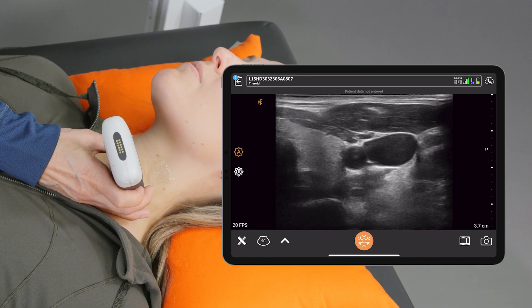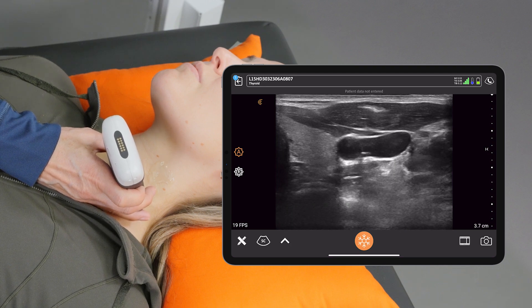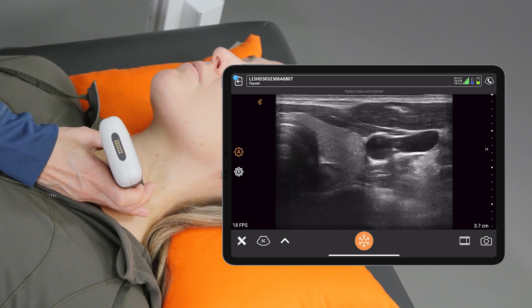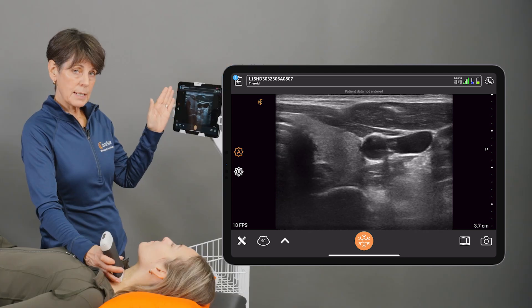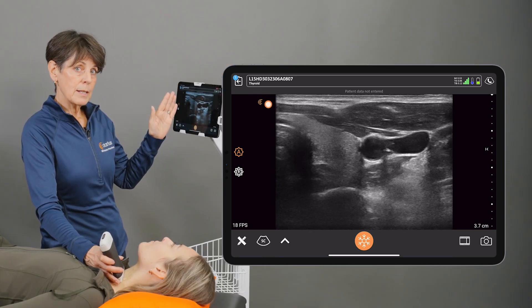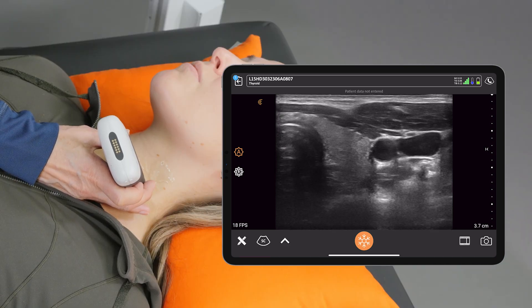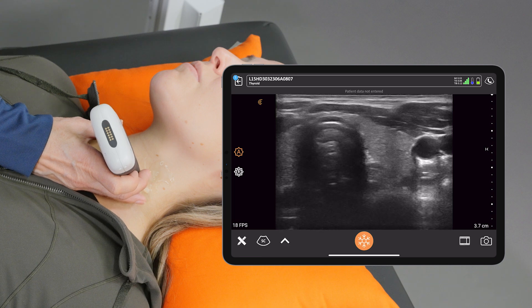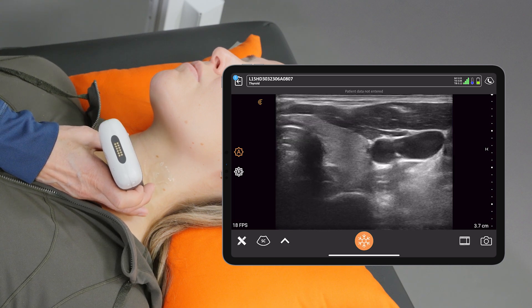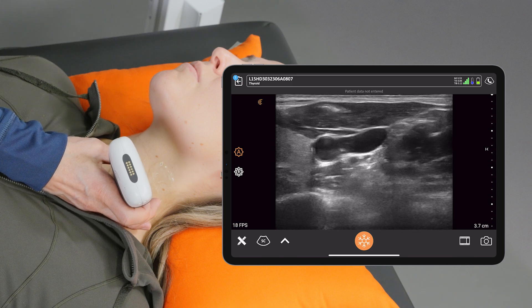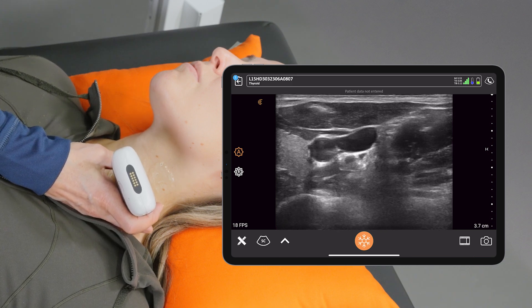When you're imaging in the transverse plane and I have that indicator to the right of the patient, everything on the ultrasound image that is on the indicator side of the image is to the patient's right. So if I slide the scanner to the right, we're going to see more to the patient's right. And if we slide more to the left, we'll see more to the left, or in this case, more toward the back of her neck.